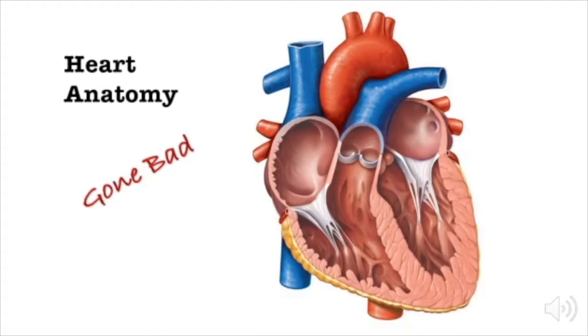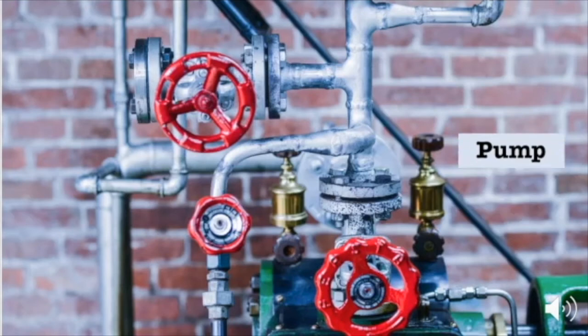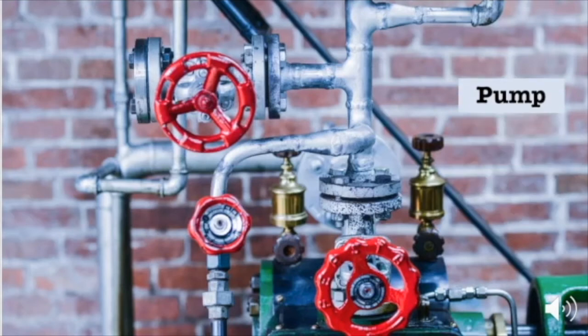Besides heart attacks, there are other conditions that can cause the pump to fail, such as high blood pressure, alcohol abuse, viral infections. The list is quite long. So the problem that an LVAD addresses is that of a broken pump, namely the left ventricle. That's where the LVAD derives its name, left ventricular assist device. Let's go ahead and take a look at what this looks like inside the human body.